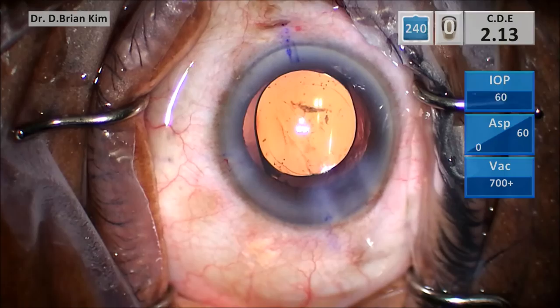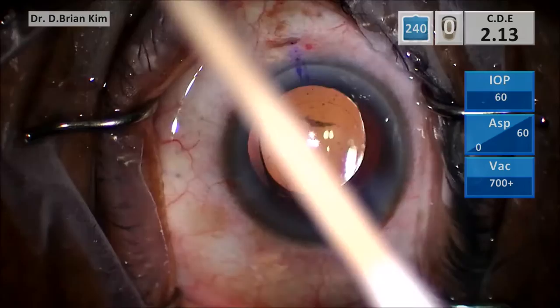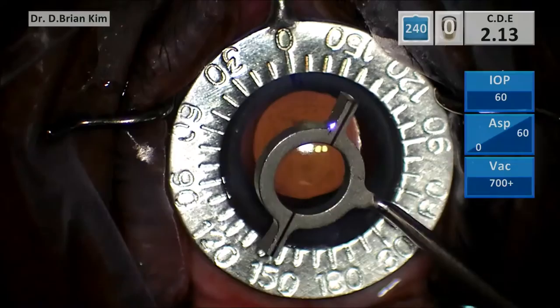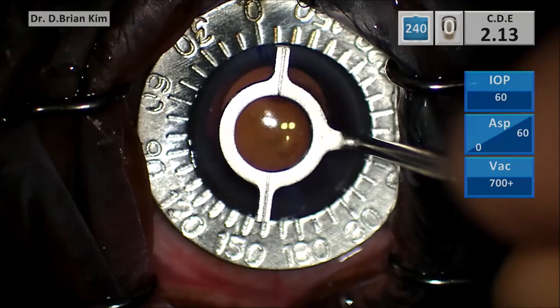The three and nine o'clock positions are well shown here. I like to fill the anterior chamber with viscoelastic to help firm up the anterior chamber, which facilitates the marking of the axis. I also like to dry the surface of the cornea, which will help the markings show up better. Then I place the Mendez ring in position, aligning the zero and 180 degrees, and use the toric marker to mark the cornea.